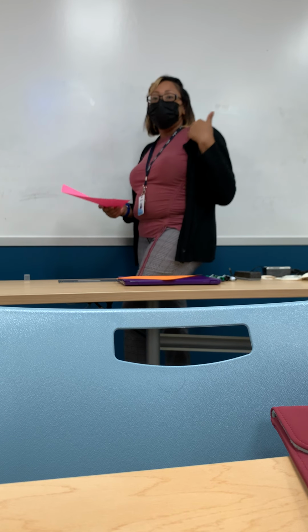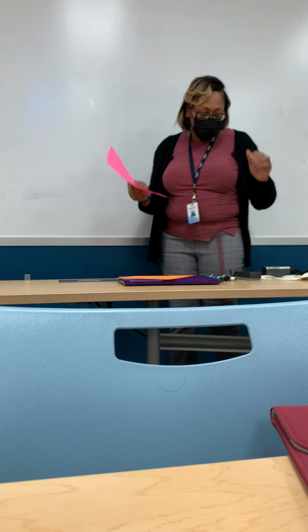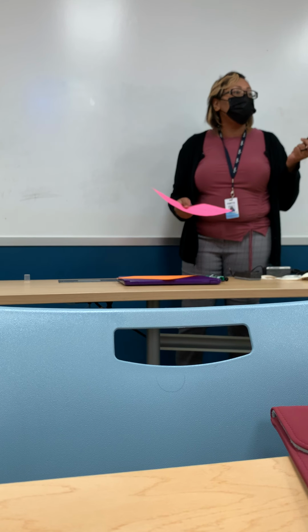If we shock our patients, with this electric activity going through the body, what can they not have on? Metal. No metal.